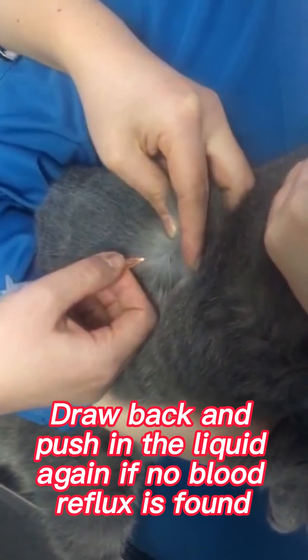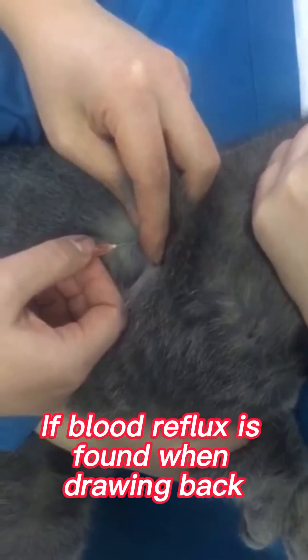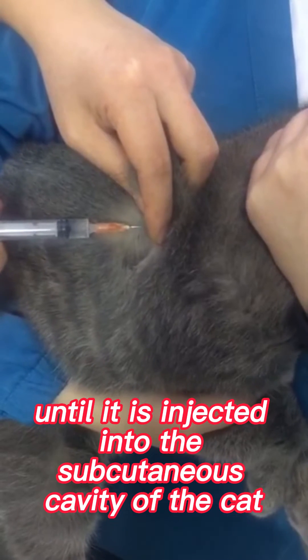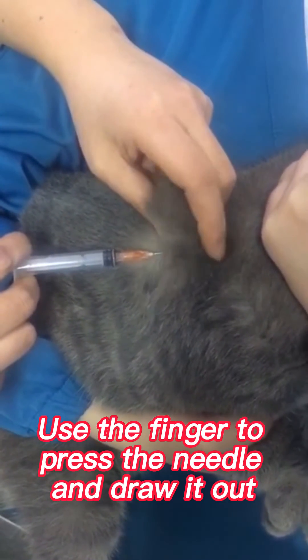Draw back and push in the liquid again if no blood reflux is found. If blood reflux is found when drawing back, the needle has entered the muscle or blood vessel and must be re-injected until it is correctly placed into the subcutaneous cavity of the cat. Use a finger to press the needle and draw it out.